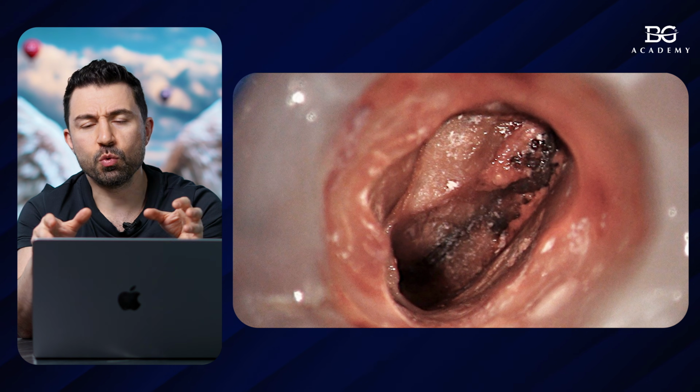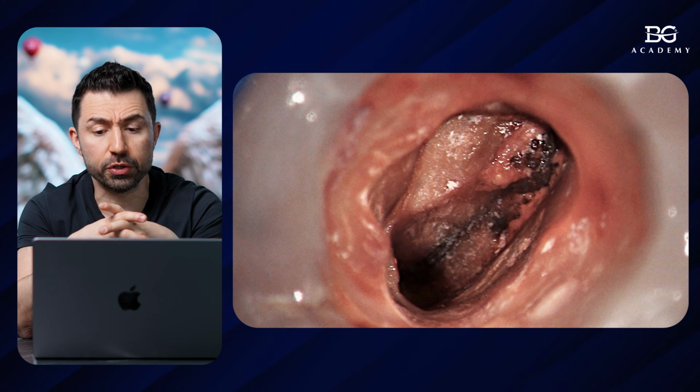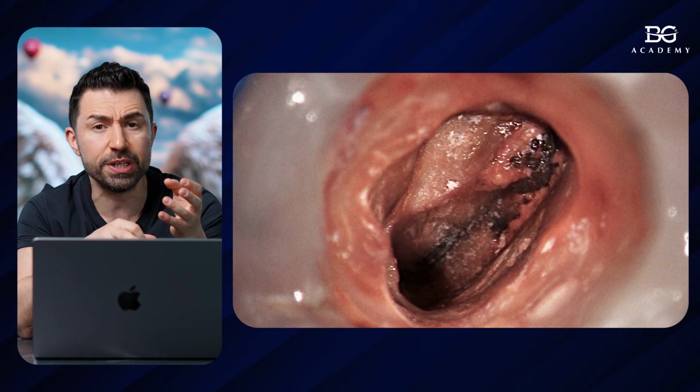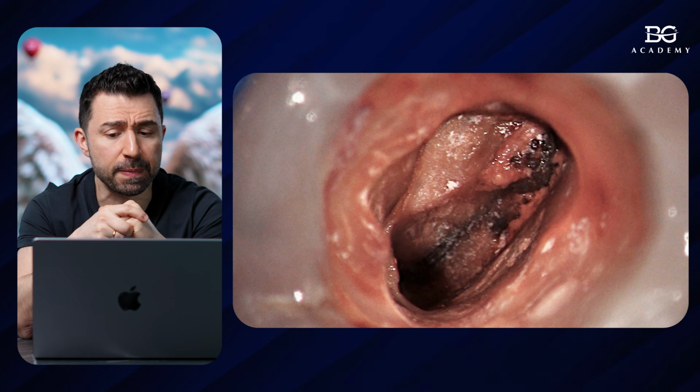There are a lot of problems with resorcinol teeth. One of the problems is the severe and hard discoloration in the pulp chamber, so sometimes it's very difficult to identify the pulp floor, to read the pulp map, to see where the orifices are, okay?